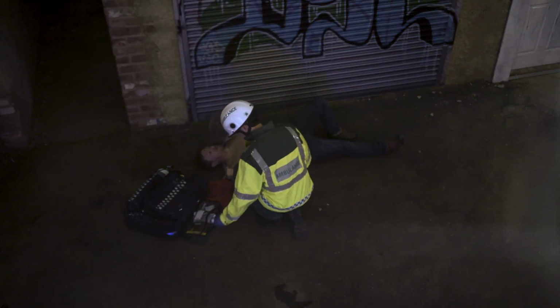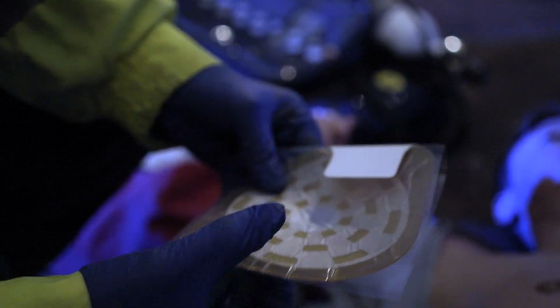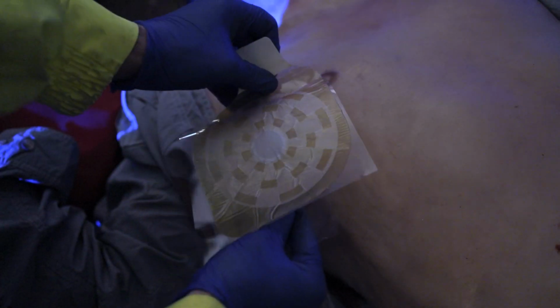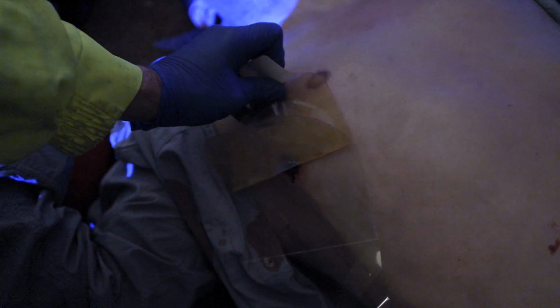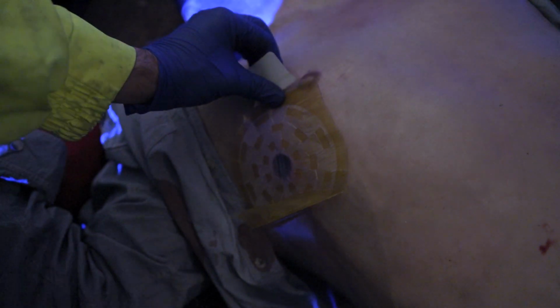Once the wound has been exposed and you have wiped the surrounding skin, open the pack and remove the Foxseal Vented chest dressing from the packaging. Grip the protruding tab and peel back to remove the Foxseal Vented dressing away from the clear liner. This will expose the adhesive side of the dressing. Be careful not to touch the adhesive side, as this has a strong sticky nature.